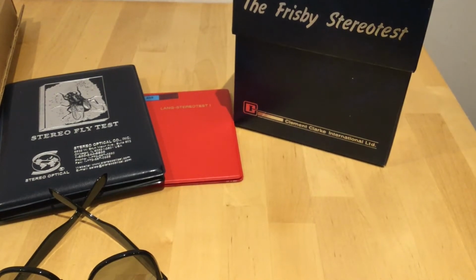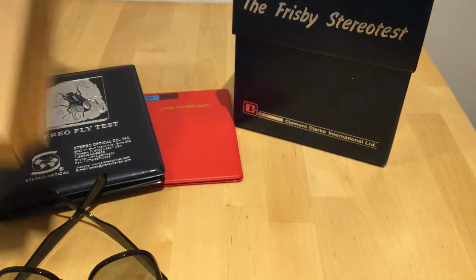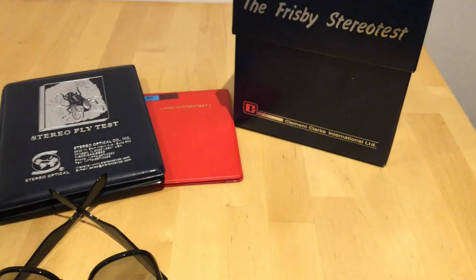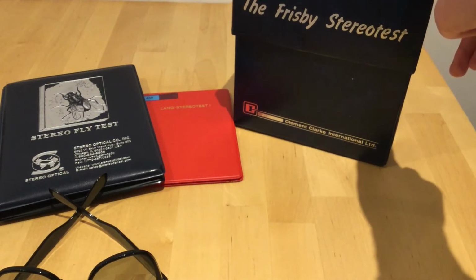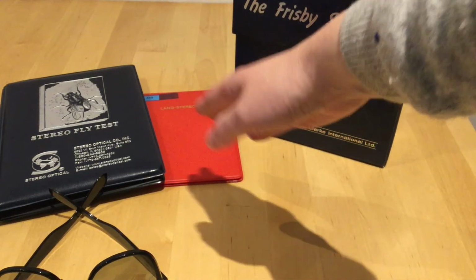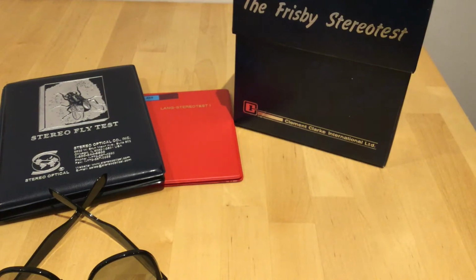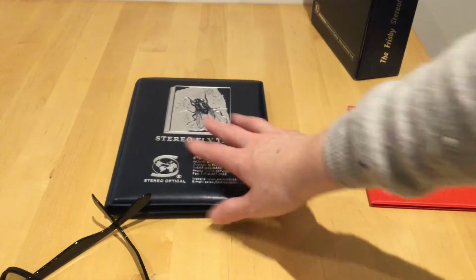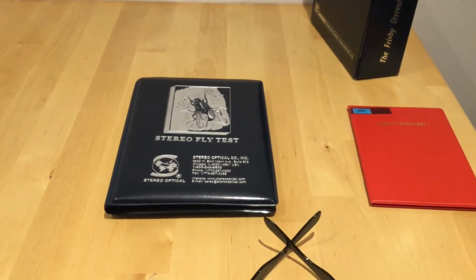In this video, we're going to be looking at 3 tests of stereo vision. The first one is called the fly test, also known as the Wirt fly test. The second one I'm going to look at is the Frisby stereo test, and finally the red book, the Lang stereo test. So let's move those two out of the way and look at the fly stereo test.